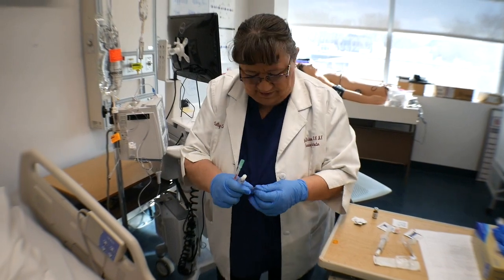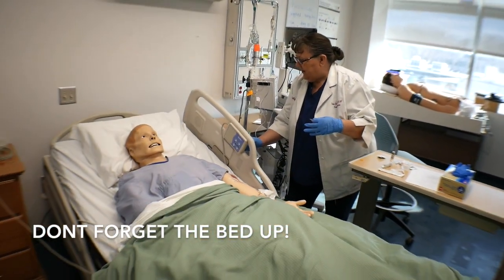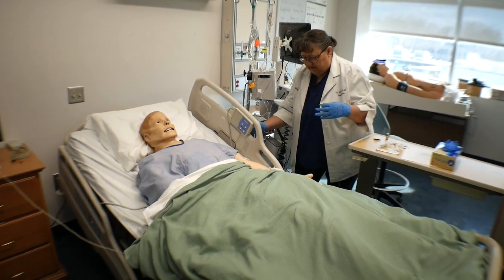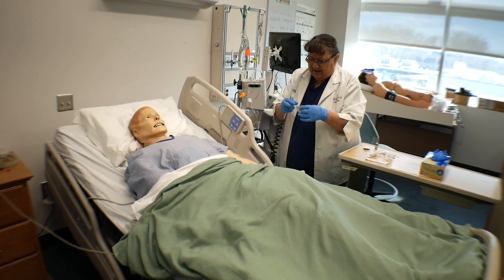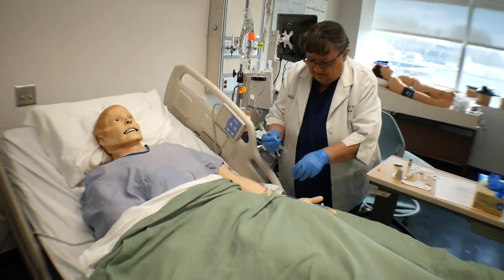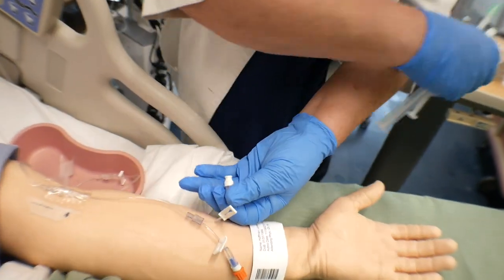So Mr. Smith, I'm going to be giving you your medication now. Put you up so you don't have to bend over. So even though this has an orange cap on it, I still need to clean it off.